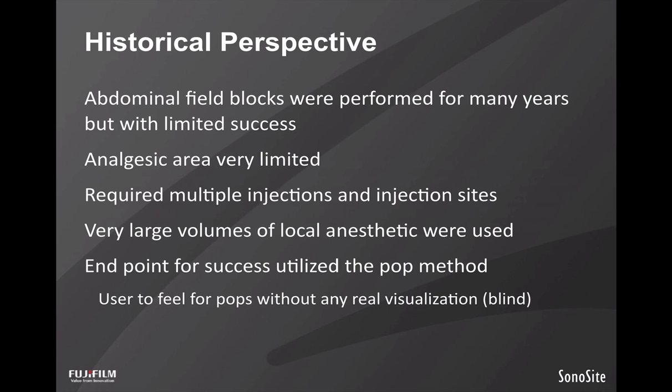As you can imagine, without the benefit of an ultrasound, a lot of it had to be a little bit of guesswork, a little bit of landmark based work, but all in all, it ended up having multiple injections and multiple sites. Also, one kind of unhappy consequence of not knowing exactly where you needed to go was very large volumes of local anesthetic were used. We're going to go into the detail about the volumes of local anesthetic a little bit in the future of this presentation, but what I wanted to make sure that everyone understands is ultrasound has allowed us to decrease the amount of volume of local anesthetic, which is obviously safer.